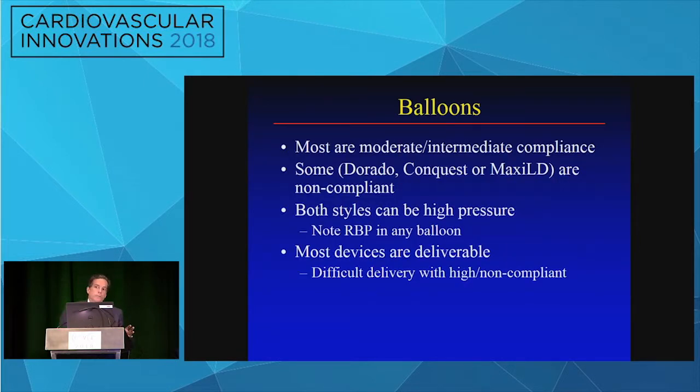Balloons are a commodity, as Jafar said, and really what's critical to balloons, if you ever lived in the coronary world, we had to learn when I was a fellow the workhorse balloons, which were very compliant, then you had semi-compliant and then non-compliant. In the peripheral world, all of these devices are almost invariably semi-compliant, which simply means they grow. But what does that mean, that they grow?